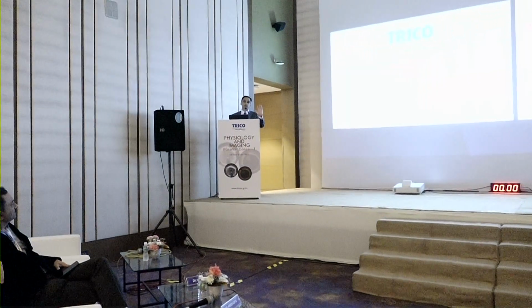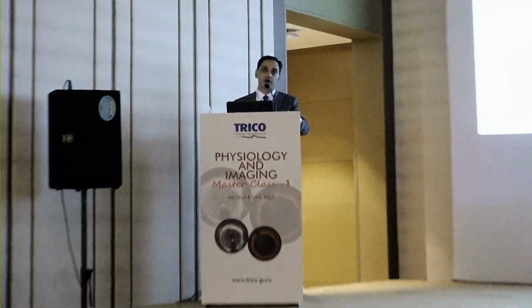Regarding the protocol for FFR, the IV or the intracoronary protocol, which do you prefer? Well, I think if you read the guidelines, it's IV to ensure good delivery. It allows you to do pullback. If you wanted to do it with FFR, you can do pullbacks with IV. But in practice, in our practice, we very often do intracoronary. But that used to be historically. Now we've switched to IFR, so we just don't need to.